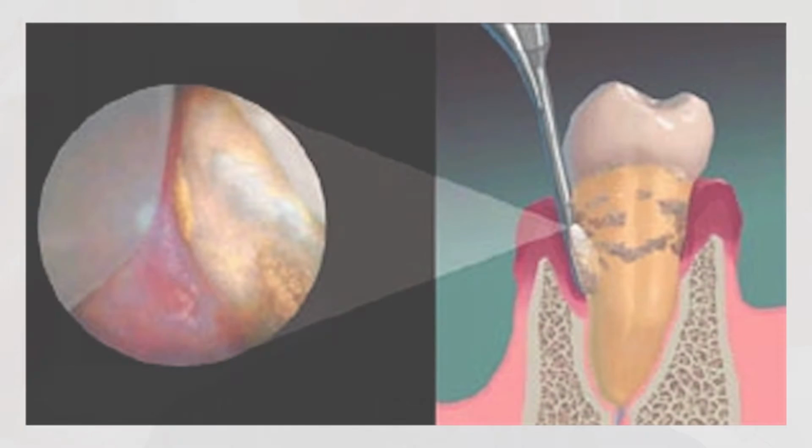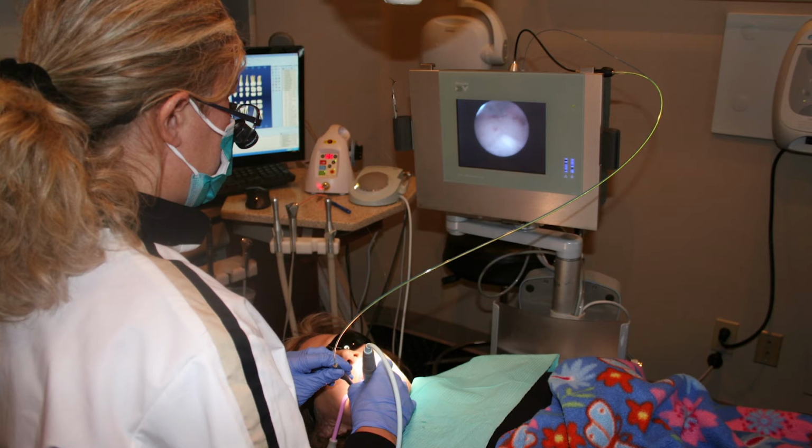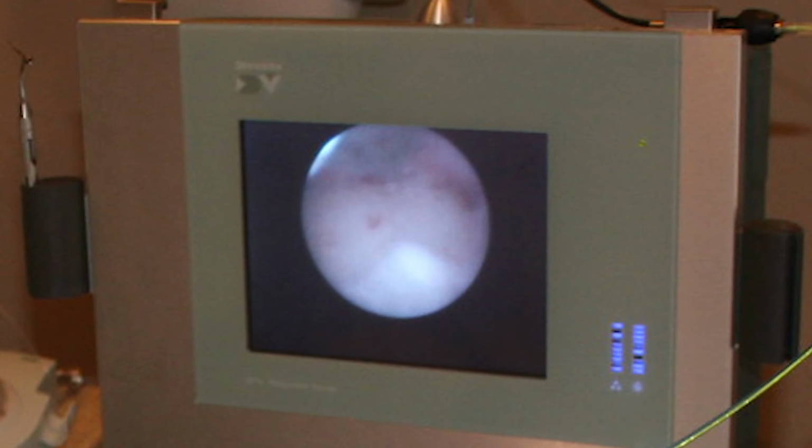The whole idea behind perioscopy, this endoscopic cleaning, is that the endoscope lets us visualize the root surface beneath the gum tissue without doing the surgical access to the site. That is, we don't need to push back the gum tissue from the roots so we can visualize it. We're able to look directly at the root surface using this camera, this subgingival camera. And what this does, in most cases, a vast majority, greater than 99%, is that patients don't need to have surgery.